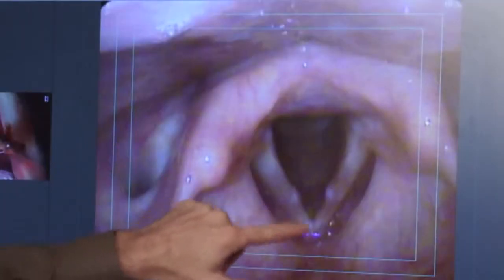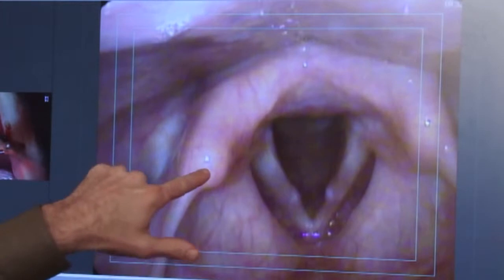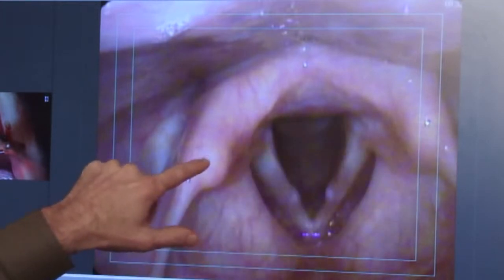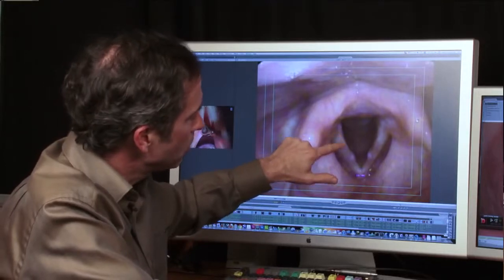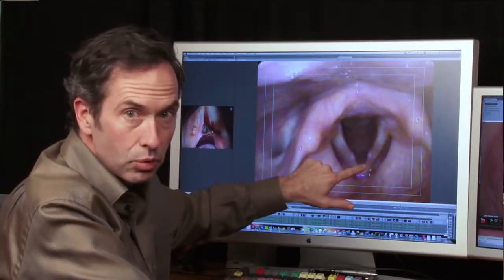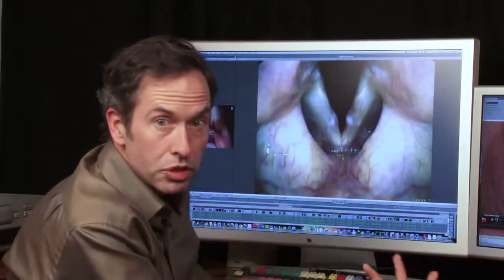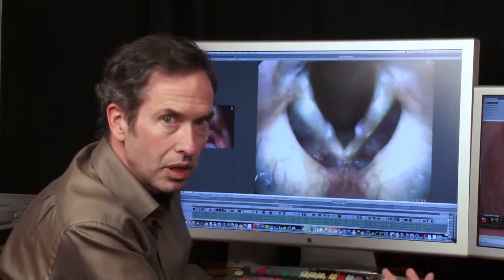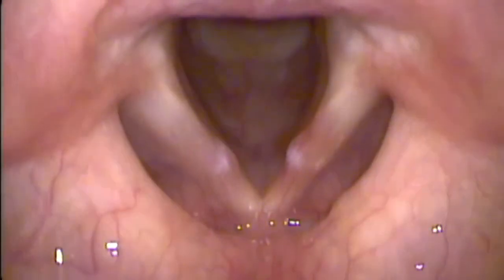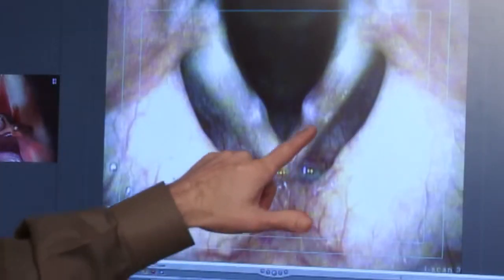One thing I want to orient you to is that everything that matters is on the vocal cord, and many singers look at this bump and say, well, I've got a big bump here. That's an arytenoid, that's normal. We want to focus on the only thing that matters, that's the vocal cord itself. So she has two big bumps. She told us she's kind of a chronic talker, so she does have sort of nodules or polyps from chronic overuse. But more importantly for our case today, she has these large dilated blood vessels.